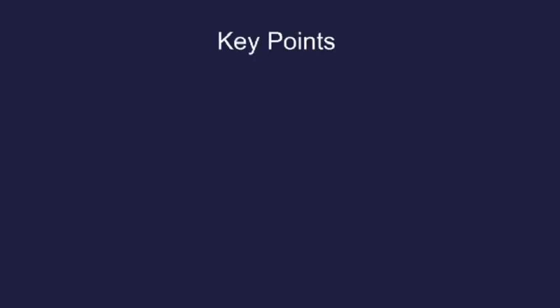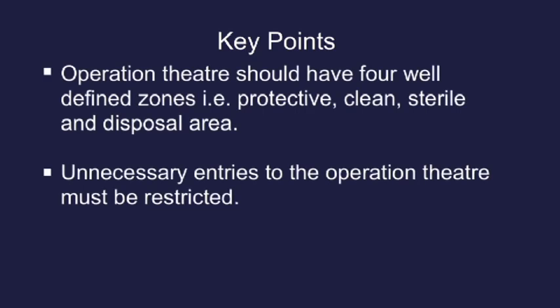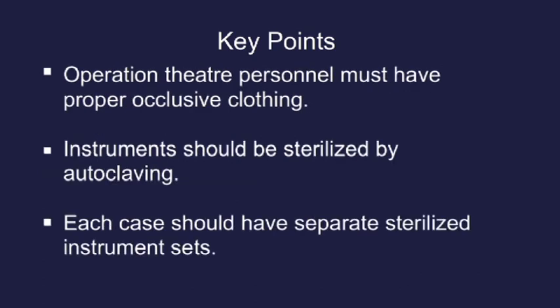Key points. Operation theatre should have 4 well-defined zones, that is, protective, clean, sterile and disposal area. Unnecessary entries to the operation theatre must be restricted. Operation theatre personnel must have proper occlusive clothing. Instruments should be sterilized by autoclaving. Each case should have separate sterilized instrument sets.